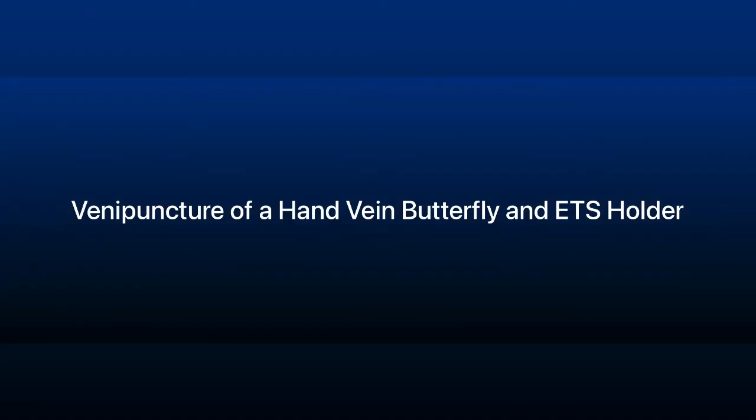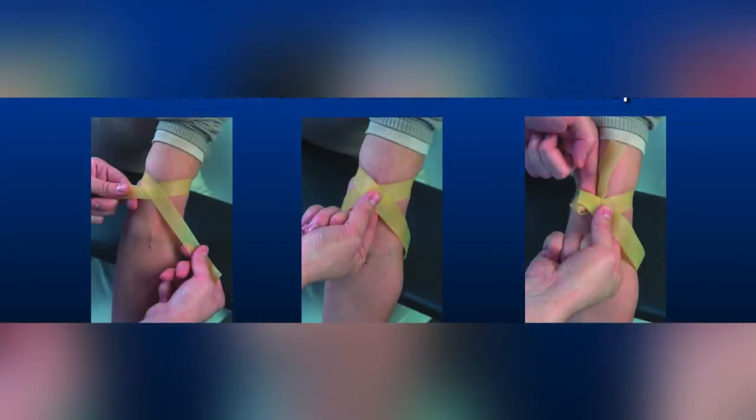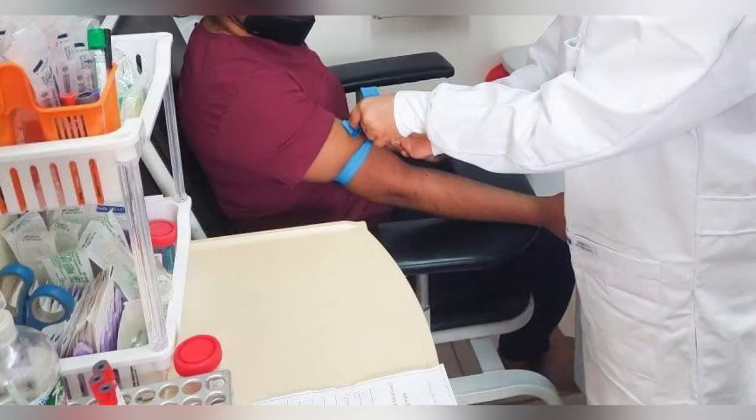Venipuncture of a hand vein using a butterfly and ETS holder. Sample as routine ETS venipuncture. Position hand, apply tourniquet, ask patient to close the hand. Select vein, release tourniquet, ask patient to relax hand.